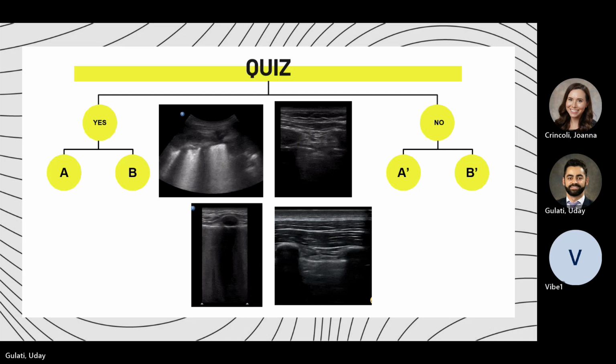So what do you think the diagnosis is in this patient? Because if I'm just doing this, I'm going to be thinking about pneumothorax. I'm not 100% set on pneumothorax, but I could be thinking about it. But when I see this, pneumonia? I don't know, right? And so I want to make sure, and what I probably want to do is take an M mode and put it down here and see if I get that lung point. Is this pulsation, am I seeing a lung point?